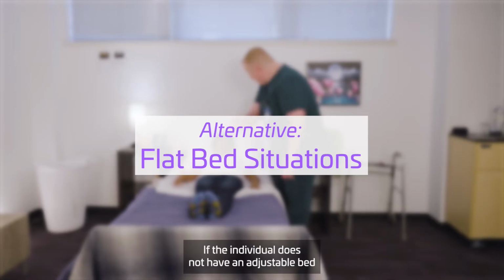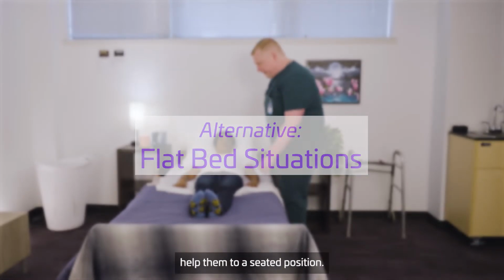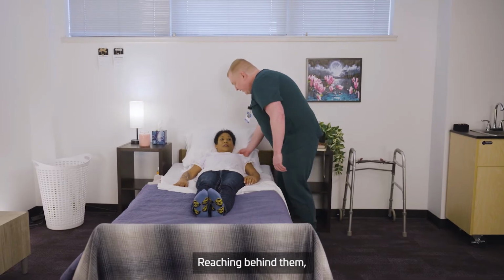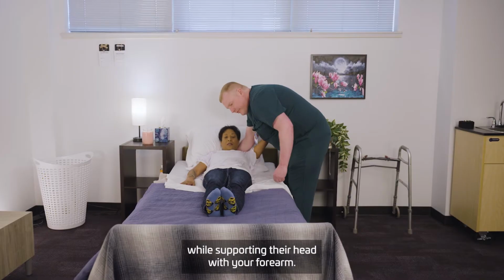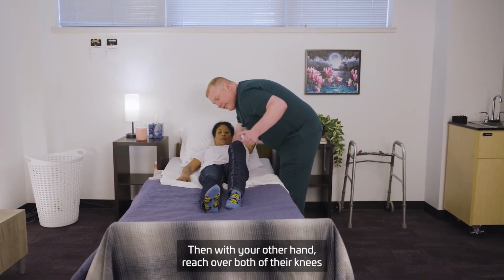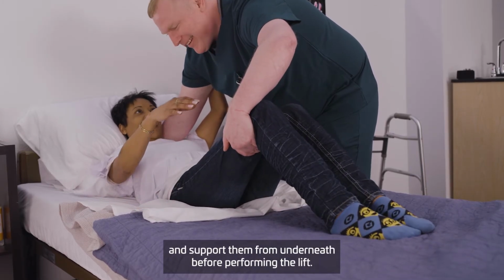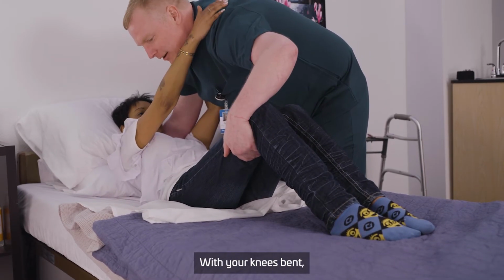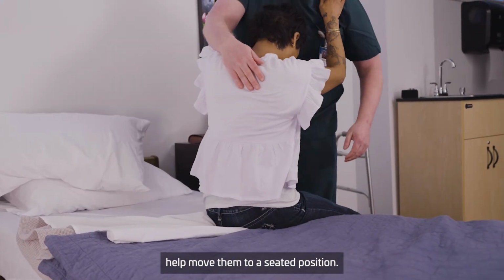If the individual does not have an adjustable bed, help them to a seated position. Reaching behind them, place your hand underneath their opposite shoulder blade while supporting their head with your forearm. Then, with your other hand, reach over both of their knees and support them from underneath before performing the lift. With your knees bent, help move them to a seated position.